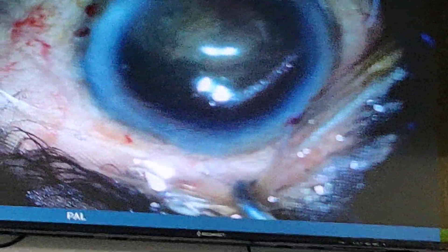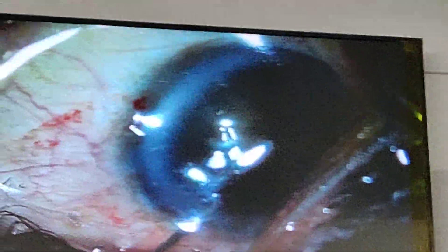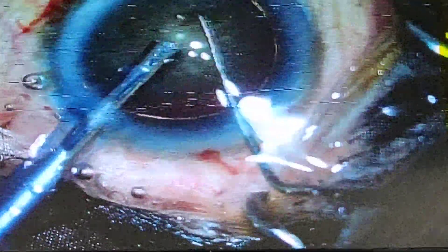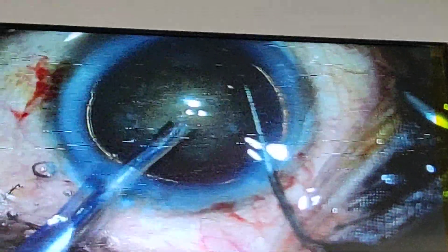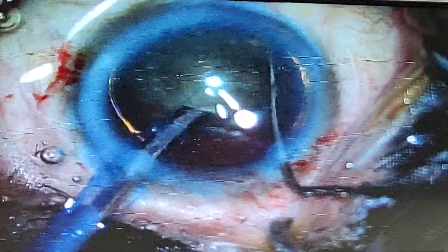The lens is free now and you can rotate the lens clockwise and anti-clockwise. You can see a very nice golden ring. The lens is free now and I am going to do the vertical chop.